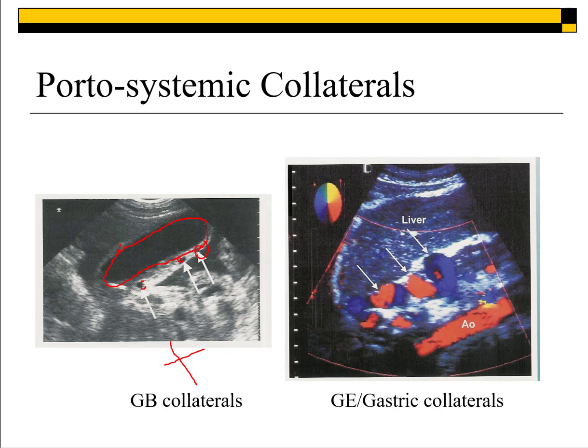Remember, we talked about how you're most commonly going to find those located posterior to the left lobe of the liver. Here we are, left lobe of the liver, posterior, and you're going to see these large tortuous collateral branches here. Again, as we talked about in the previous diagram, you can see how that blood flow is now leaving and shunting and coursing towards that area.